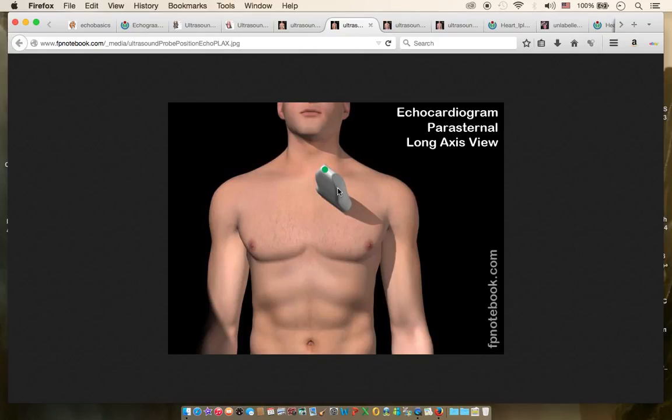There are different types of transducer, and the smaller one is the best. Why? Because you can push it into the intercostal space to reach the heart and pick up a very clear picture. Ask the patient to lie in the left lateral decubitus position, because the heart in this position is closer to the chest wall.